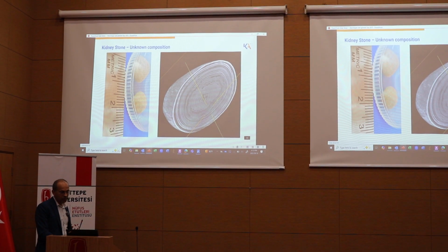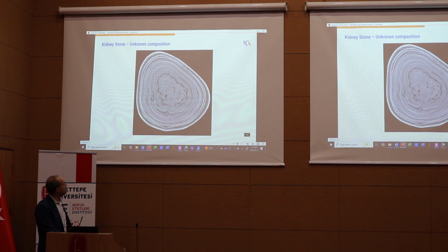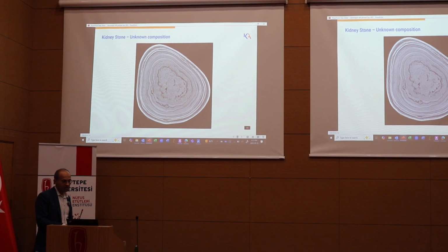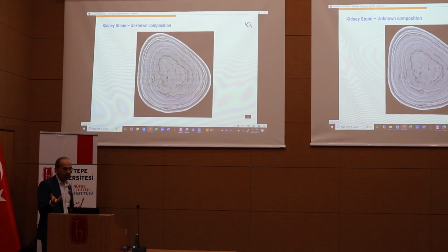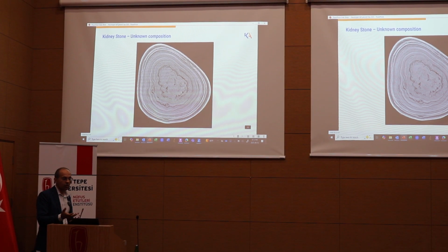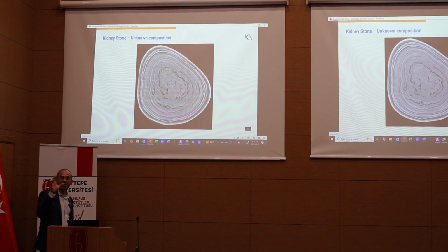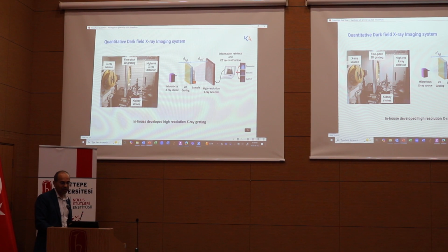Kidney stones, if you want to look at the structure of the kidney stone, beautiful views. This is a multi-material kidney stone, you know, lots of different things as it forms in waves. You can really see quite a lot of beauty in this. It has a lot of similarity to how rocks form in the water, underwater in oceans and coral. But this happens inside a body. It's like the waves of liquid washing up in the kidney, and then it forms these stones over time, and different materials crystallize and grow. Remarkable, actually.